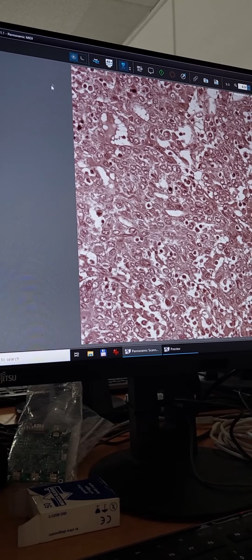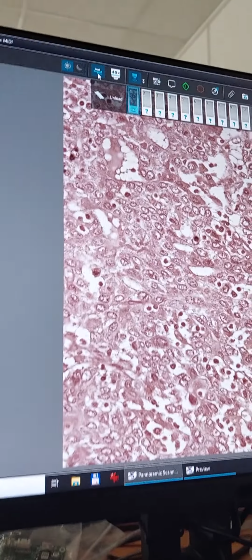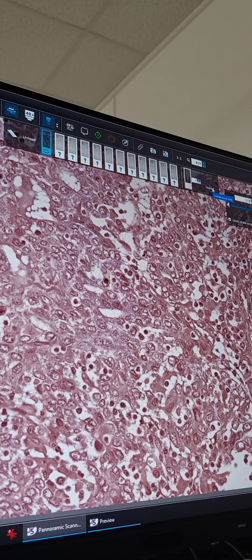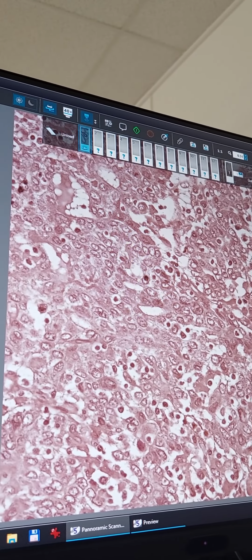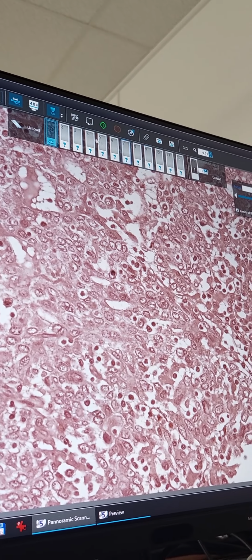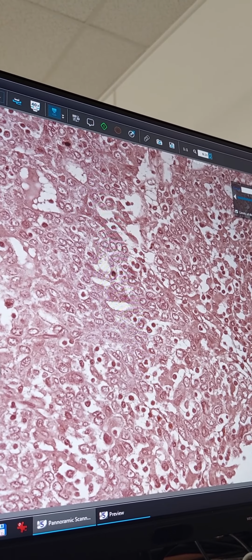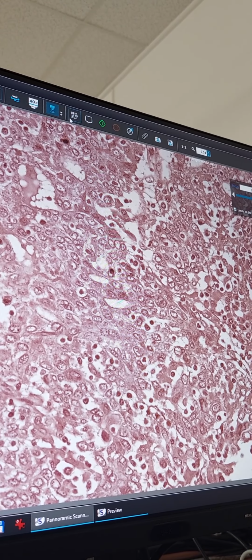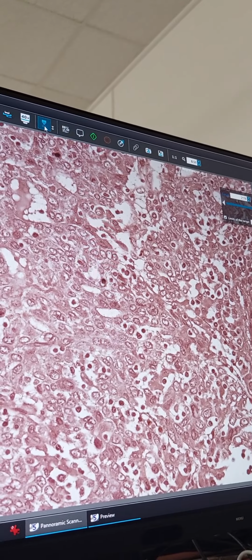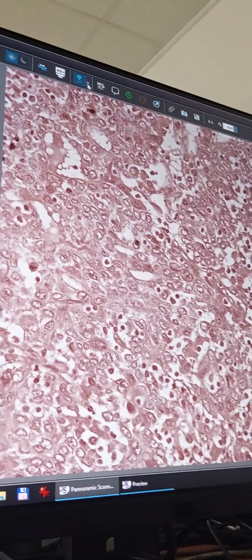And on the top part of the software, you can handle the magazine. You can unload one slide to the magazine, or unload the whole magazine. Or if you click on a slide, it is just simply going to be loaded. You can adjust the objective, but now we only have one. You can have useful functions under the live imaging button.